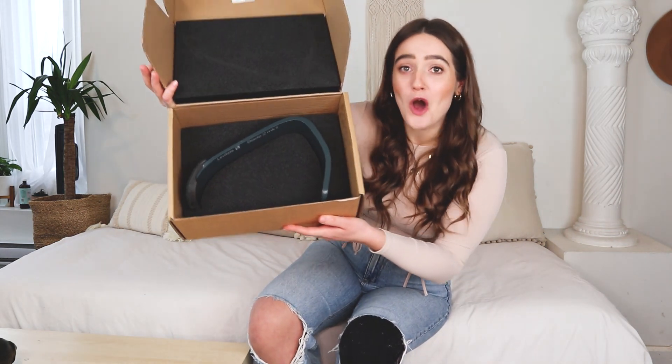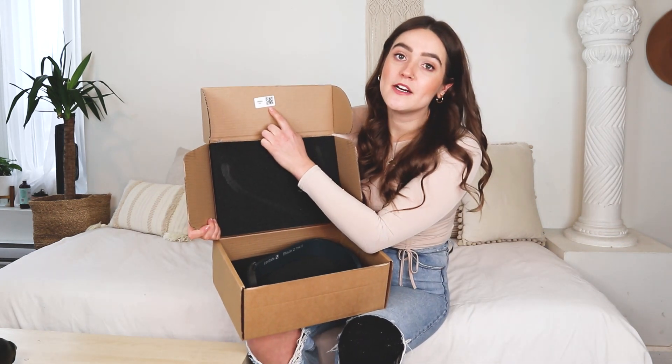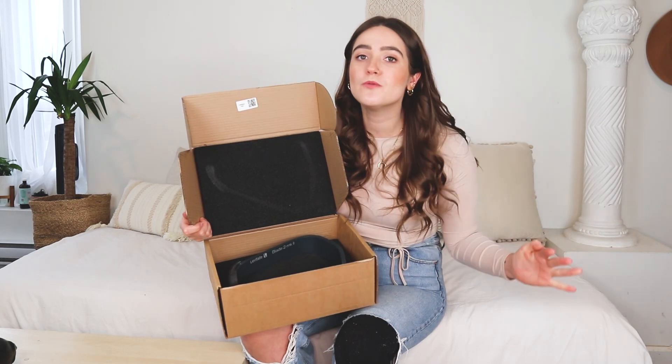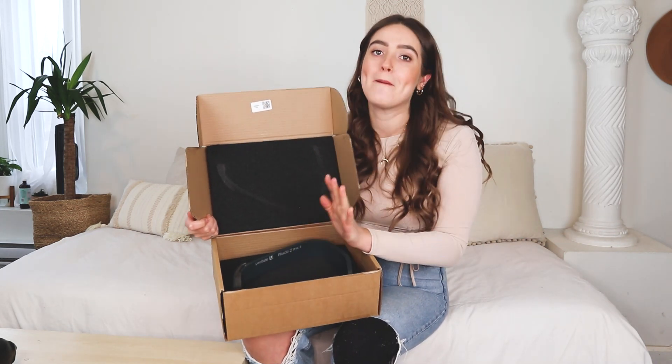When you first open the box, there is the beautiful blade itself in all its glory. They actually have a QR code right here — you can scan it with your phone and it gives you a YouTube video of a step-by-step tutorial on how to assemble this foot by yourself.